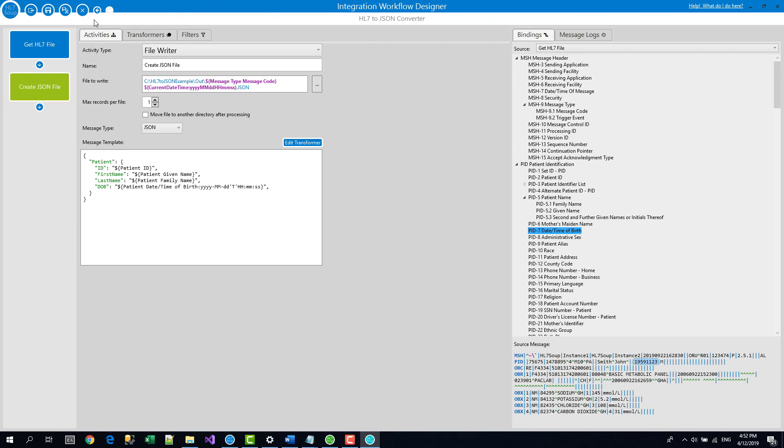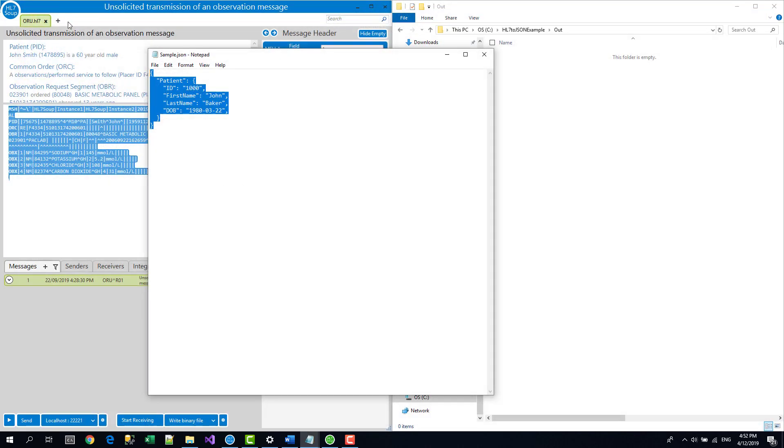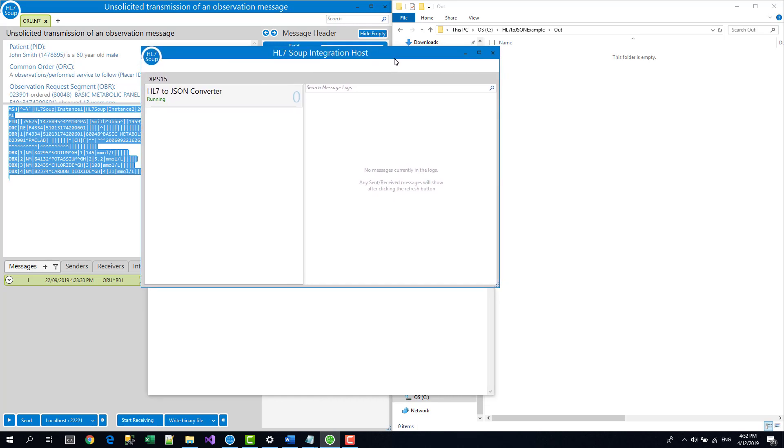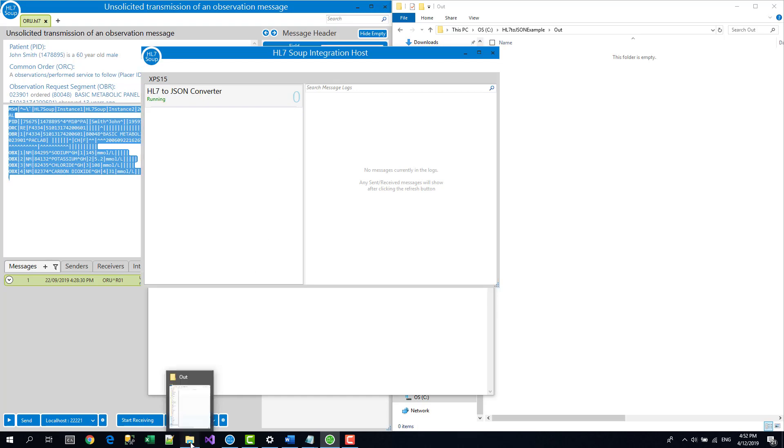I'm going to name this workflow and it's going to be called HL7 to JSON Converter. And that's done. So I'm just going to hit the save and close button here. And if we navigate now back to the integration host, we'll see that this converter is sitting there running and ready to go. And it's processed zero messages so far.